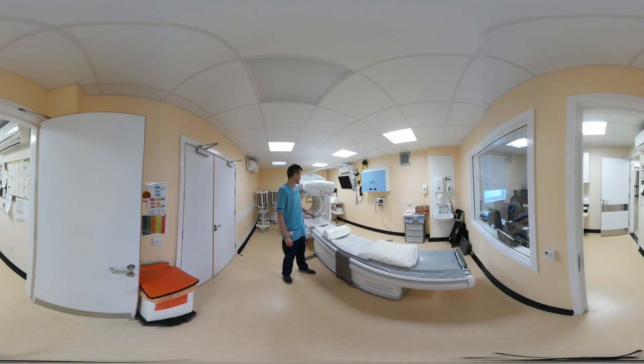This is the scan room. This is the gamma camera. It has two detectors, front and back. This is the scanner table. This is where you lie down for your scan. It will raise up, and then slide you in for your scan, and then move you out as the scan goes underway.